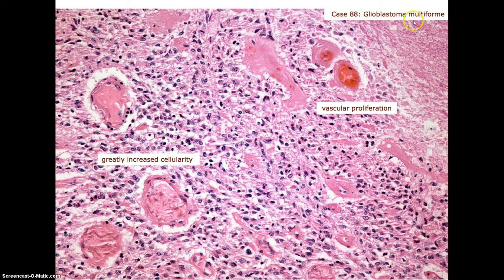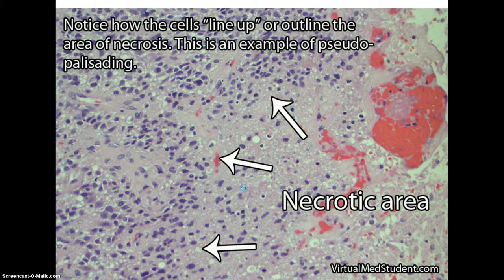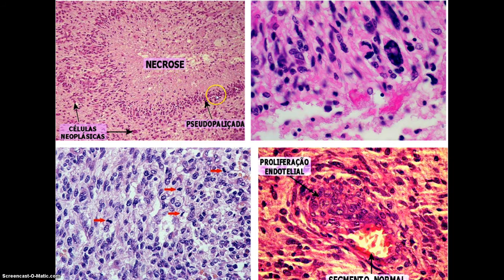The classic glioblastoma multiforme has vascular proliferation — we see the pink color surrounding the blood vessels, the thickened basement membrane, and greatly increased cellularity, with all the blue dots being nuclei. There can be sites of necrosis, and the cells close to those will be palisading away. We have the necrosis sites, the pseudopalisades, and then the neoplastic cells, where we would expect to see Ki-67 staining for the mitotically active cells.